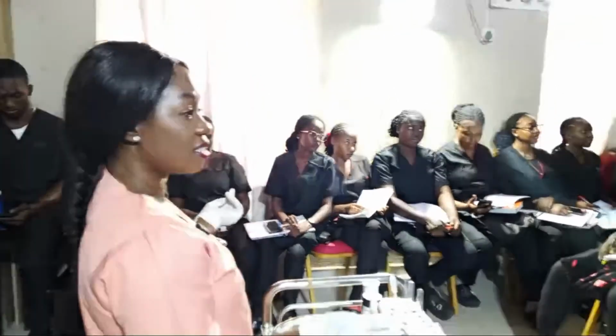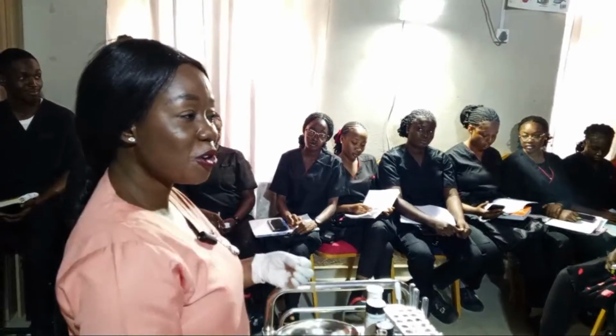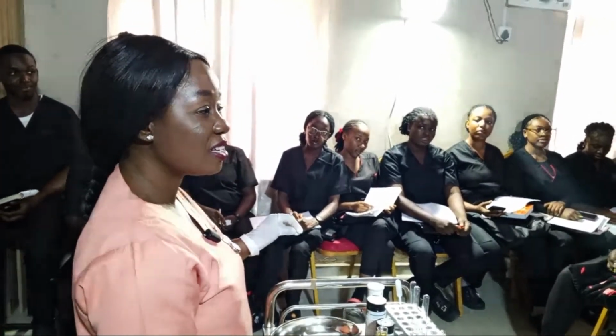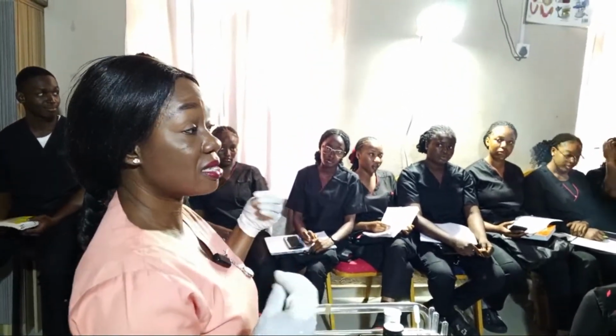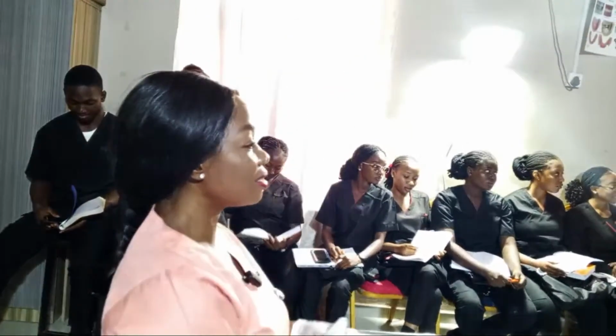Raise your hand. Remember to be orderly. Yes. Okay, we check for the odor. And what is the odor of the urine? As you know, aromatic or characteristic smell, right? So what's the next thing when we want to carry out physical exam? Yes, you at the back.